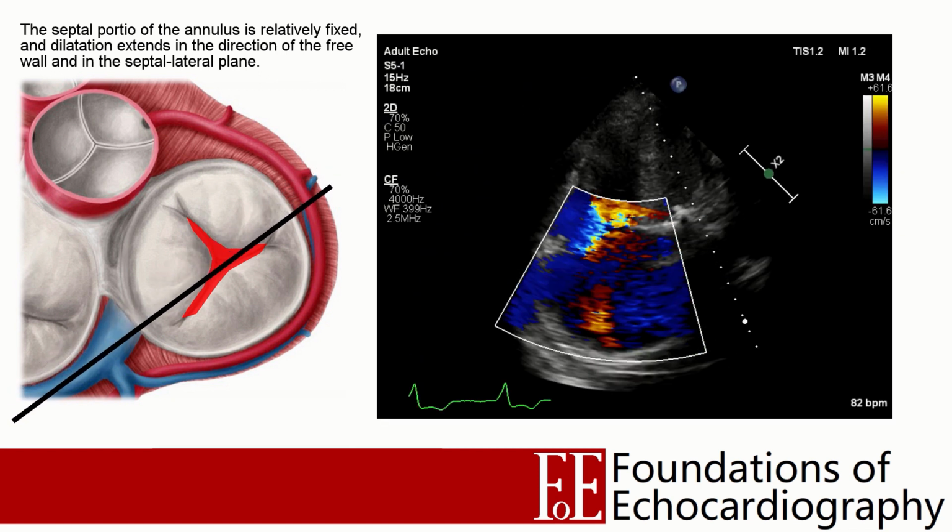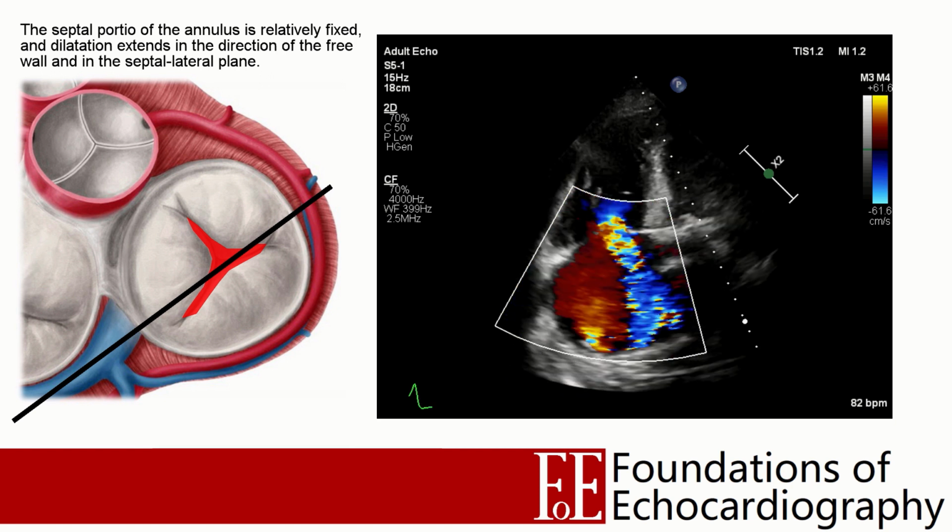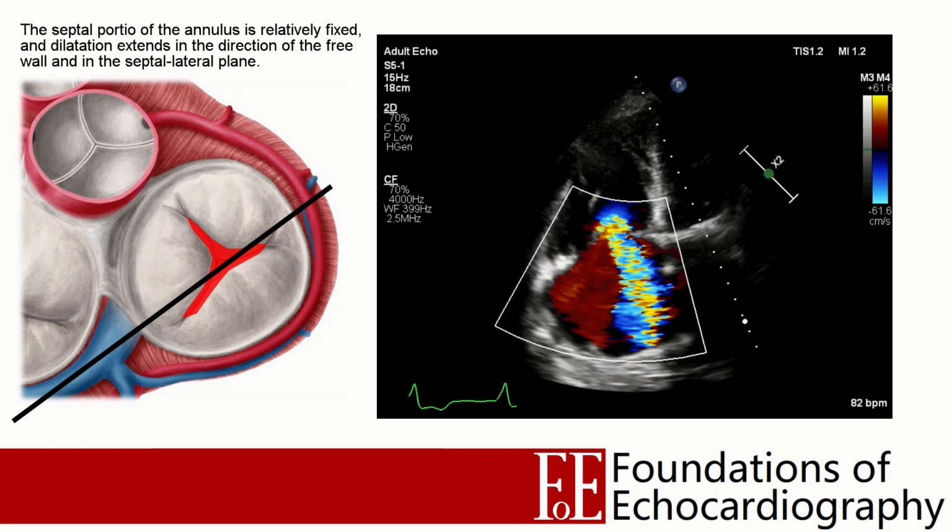This highlights the importance of tilting the probe and panning throughout the valve, as here we can see a very subtle change in angle has revealed a much greater jet.